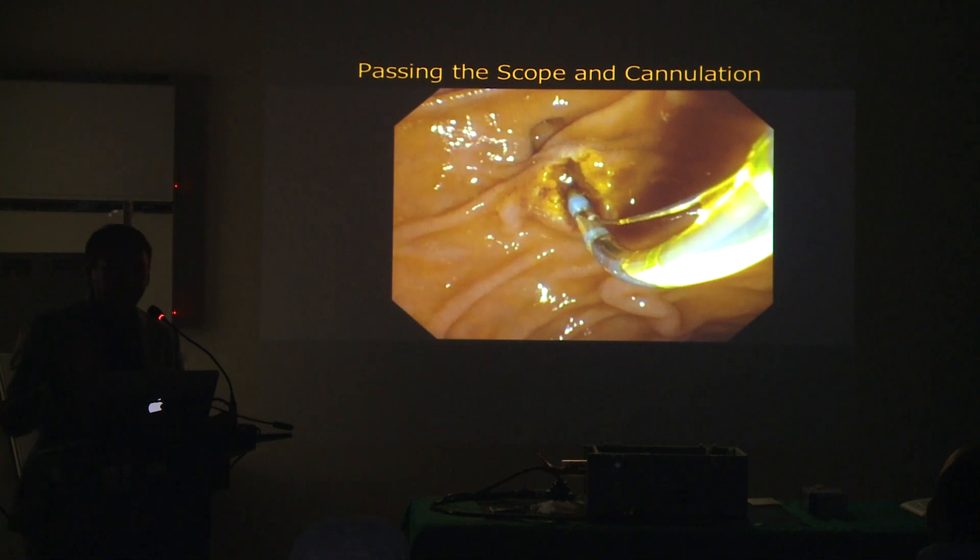When you do cutting of the sphincter, that muscle takes a little different cut. When you get to the duodenal wall, you will see a little more whitish tissue. When you get to that area, just stop there — that means you may have cut completely and should not cut any further. It's going to come with experience, but it will eventually come.